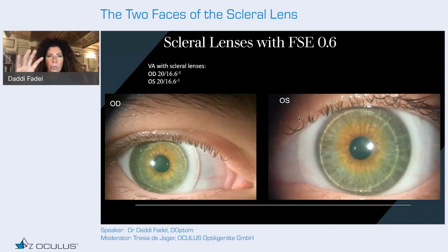And I would like to remind everyone that more than half of the eyes, about 67% of the eyes, are asymmetric. So toric lenses are not enough. Quadrant-specific designs and highly customized lenses are needed, and the larger the diameter of the lens, the more the lens should be customized.